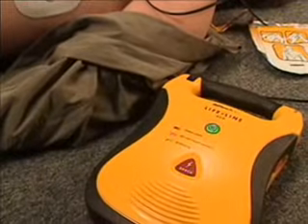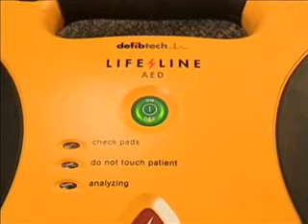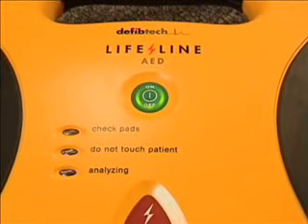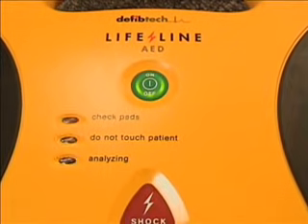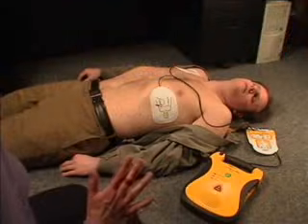The Lifeline AED will automatically check the pad connection to the victim and will begin to analyze the victim's heart rhythm. If the AED determines that the victim requires a shock, the unit will automatically charge and will prepare to deliver a shock. During this time, do not touch the victim.